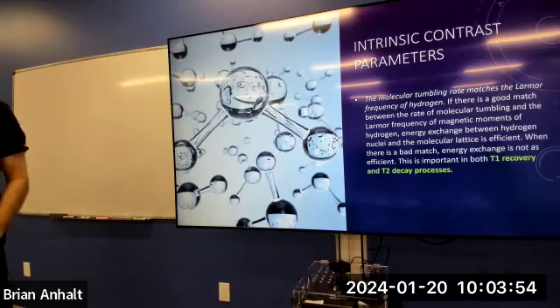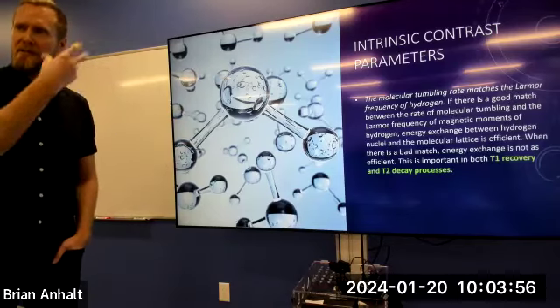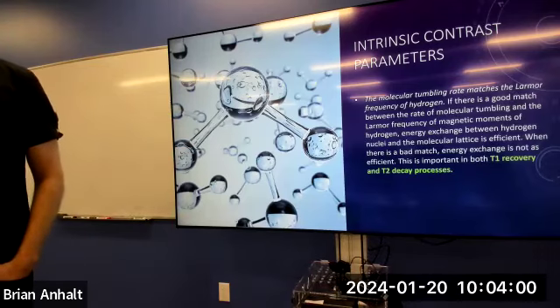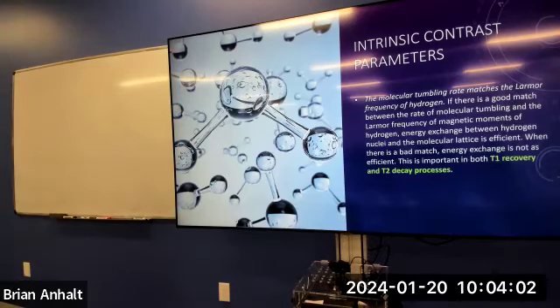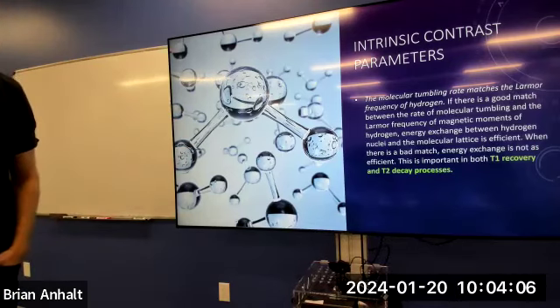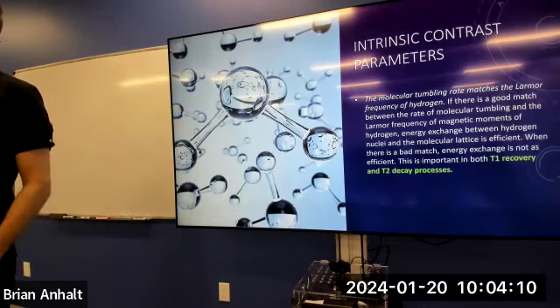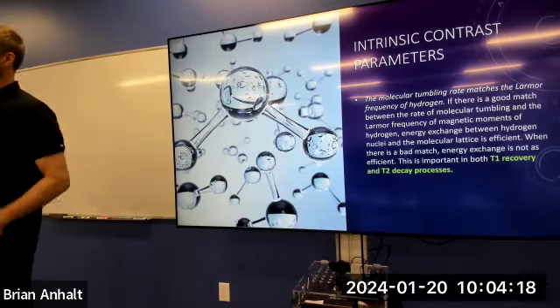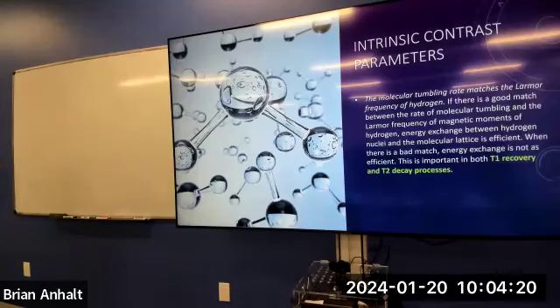You sort of have to understand the physics of chemistry to really get the idea of what a molecular tumbling rate is. Kind of like spin, same thing. It's a little bit abstract, but you can think about it as a vibration or an oscillation on a molecular level. So water has a particular molecular tumbling rate, and fat has a different one. They vibrate at different frequencies.